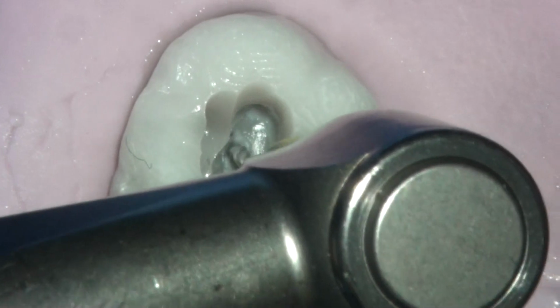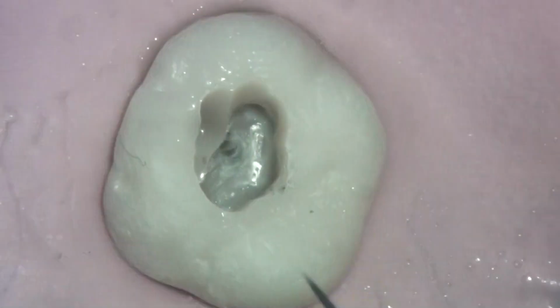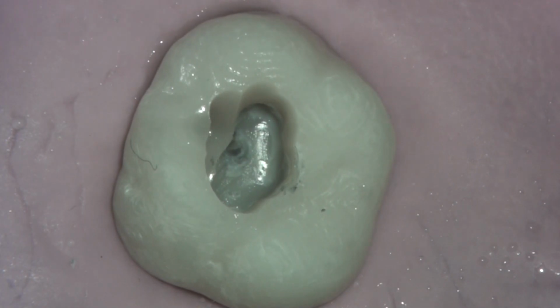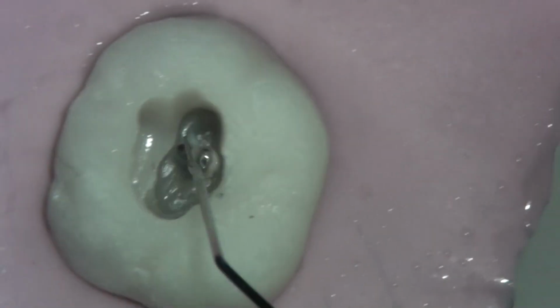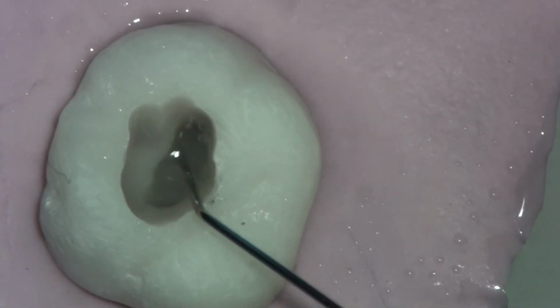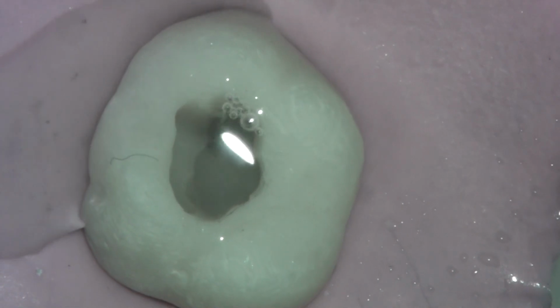In it goes in 3 passes, and a lot of brushing towards that mesial interference. And you can see the debris that has now been created, and more importantly, you can start to visualize where this actual root canal orifice is a little bit better. We go in with our irrigant, and we get rid of all of that debris, and we look down, and we can see that we've got a canal opening.